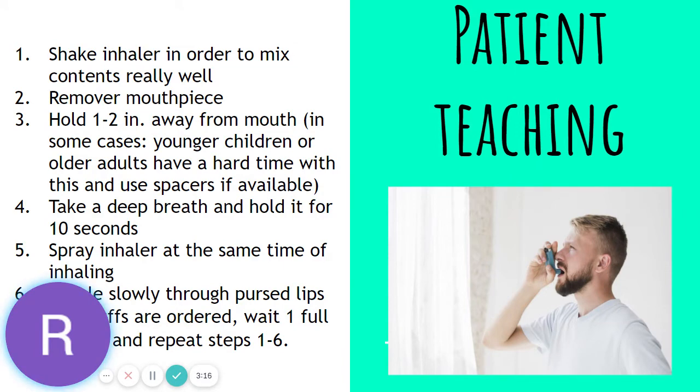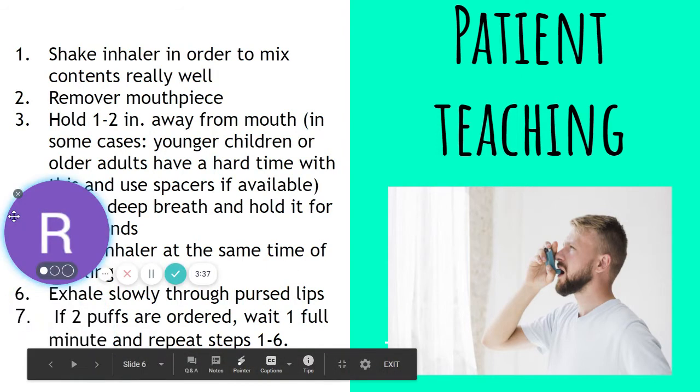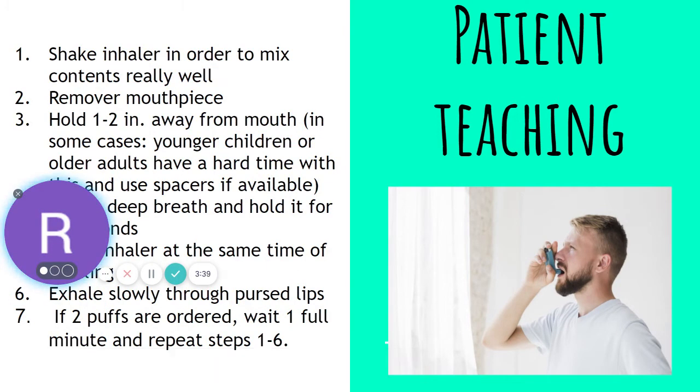As they're taking in a deep breath, make sure to tell them to hold it for 10 seconds. As they're taking in that deep breath, they spray the inhaler at the same time. And make sure to tell them to exhale slowly through pursed lips. If 2 puffs are ordered, wait 1 full minute and then repeat steps 1 through 6.